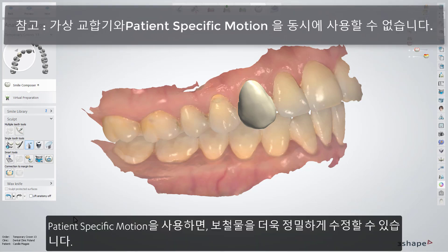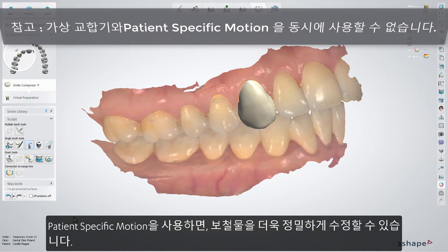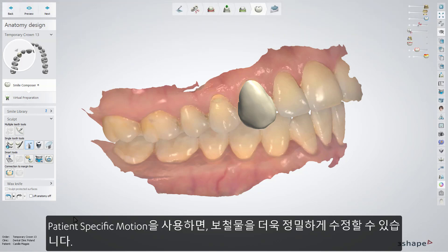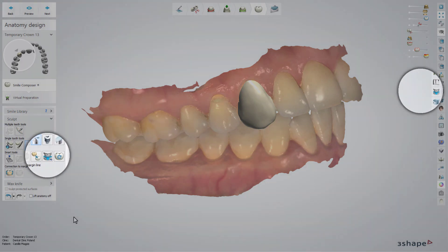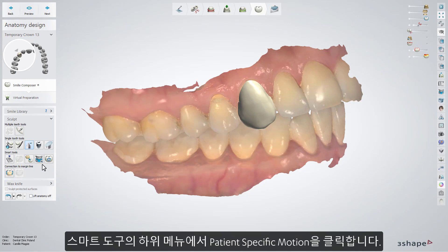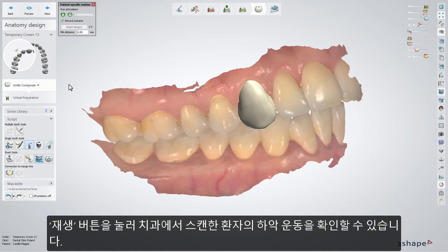When the restoration has been designed, you can adjust it even more precisely with the patient-specific motion option. Access it from the Smart Tools menu and from the Visualization menu on the right side of the screen. To enable it, choose this option from the drop-down menu in the Smart Tools and press the Play button.